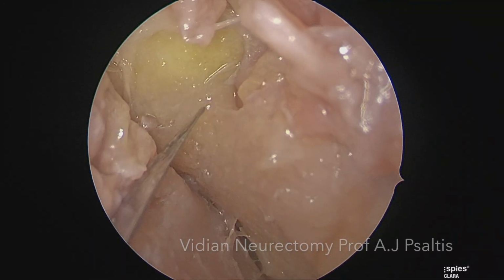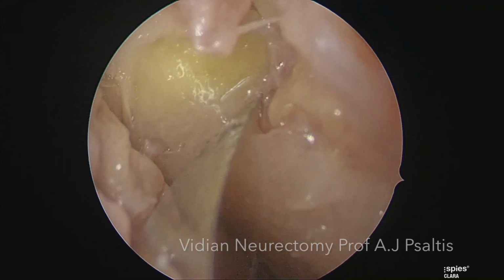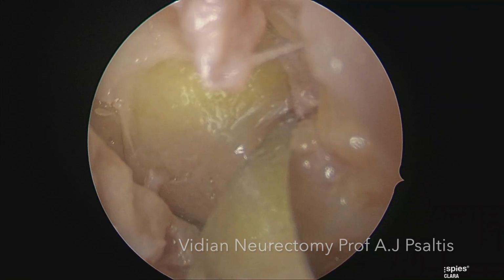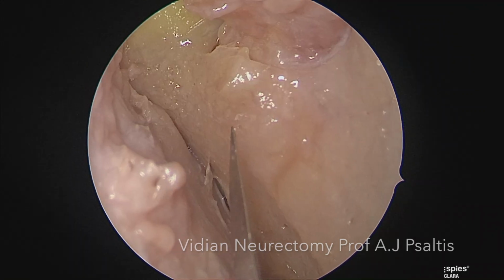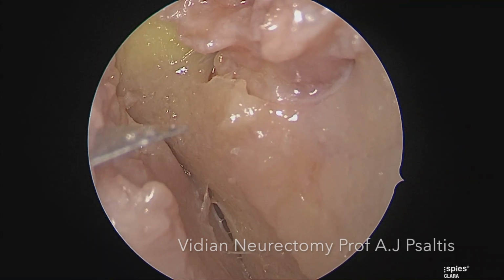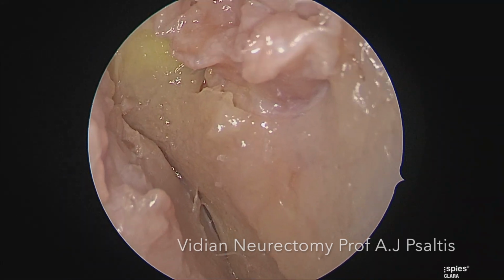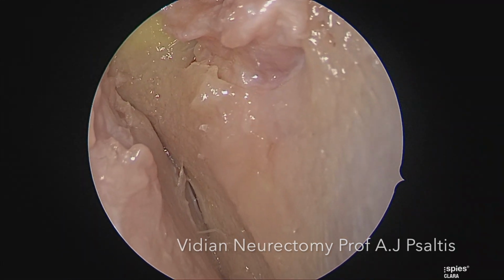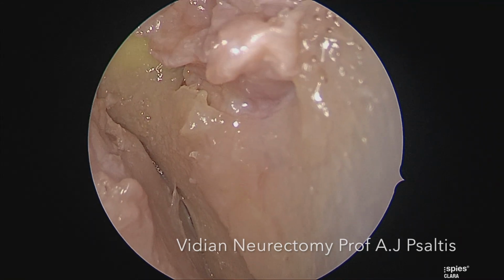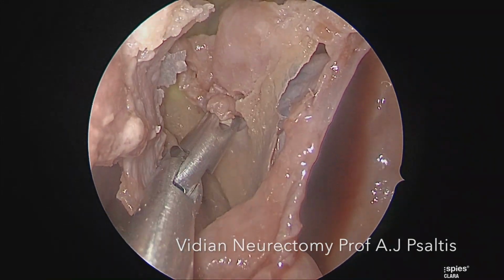Here we can see the orbital process and the sphenoidal process of the palatine bone making the sphenopalatine notch. It is important to visualize both processes and to remove the bone intervening between the two. Removal of this bone will allow you to gain access to the Vidian canal. Using a Blakesley, this bone can be easily fractured inferiorly, as demonstrated here.